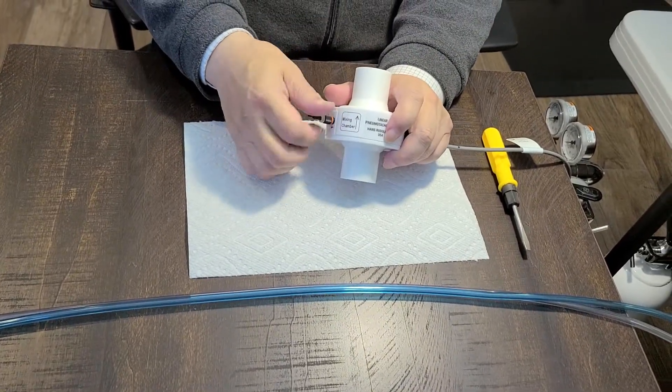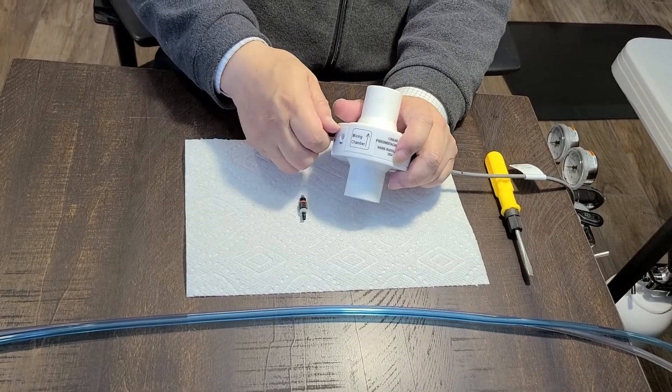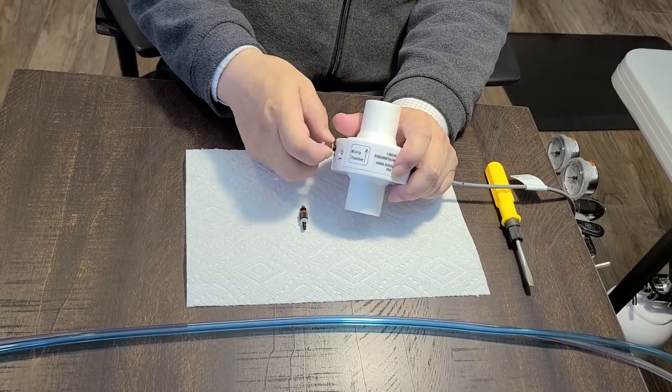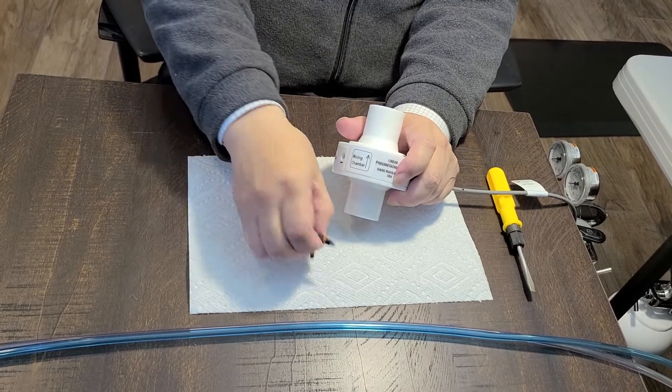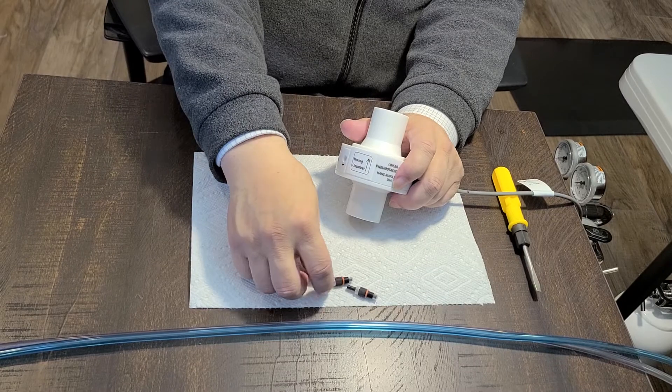Second step, unscrew the black pressure connector. They are the same if they are in good shape.